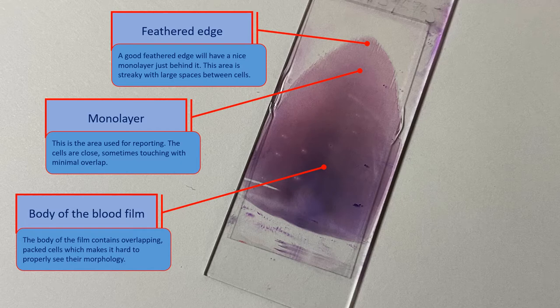The length of the blood film is also important and should be roughly two thirds of the whole slide. Depending on the reason for the blood film — for example, if a manual differential count is to be performed — a short film would be too thick and the monolayer wouldn't be enough to count an appropriate number of cells.